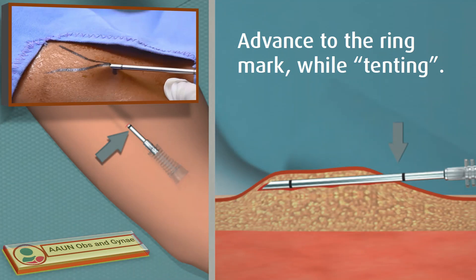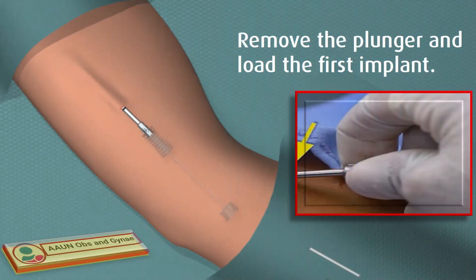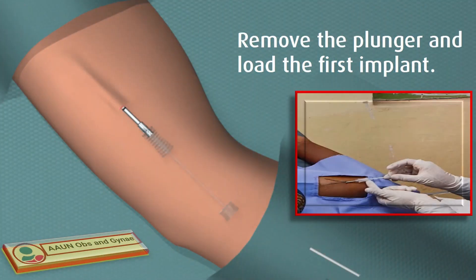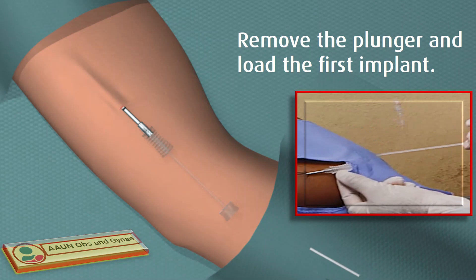Advance the trocar beneath the skin about 5.5 centimeters from the incision to the mark closest to the handle of the trocar. Do not force the trocar — if you feel any resistance, try another direction. Next, remove the plunger when the trocar is advanced to the correct mark.